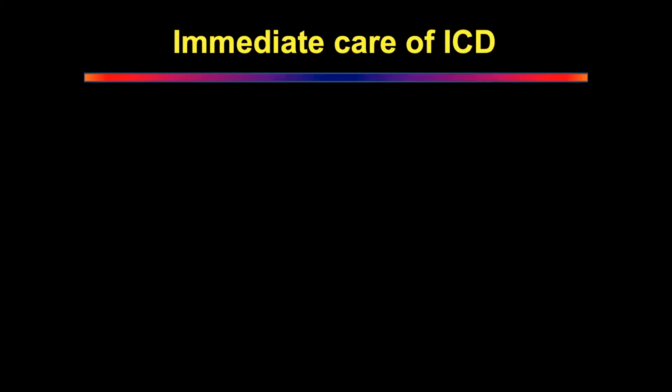Sir, you're saying constantly that the pressure should be regulated. It should be minus 2 kilopascals. So what happens if we... It depends, it's just whatever. For example, different surgeons can have different levels. We can kind of direct a post-op patient directly to the wall suction. Means, is that allowed? Sorry, I didn't understand your question. I mean, can we connect the drains to higher pressures to facilitate faster clearance?